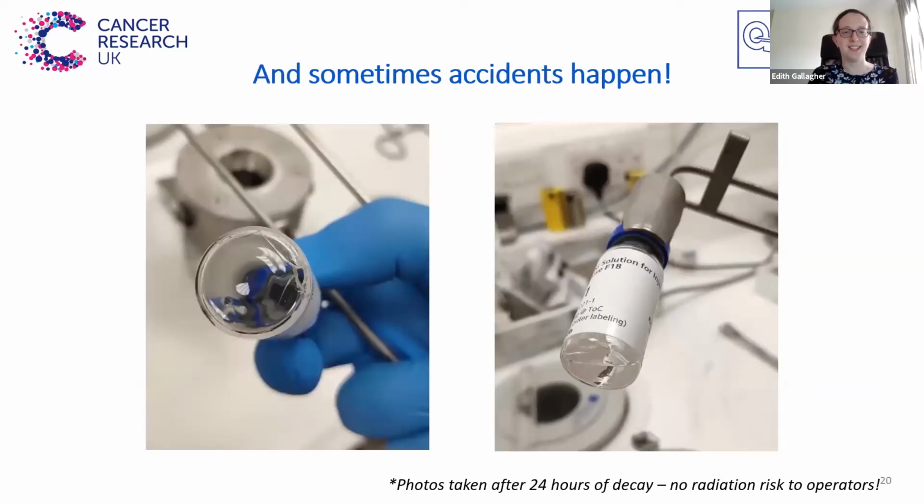And sometimes accidents happen. This is a vial that was recently delivered to a department which was discovered to have cracked in transit. It meant that a number of patients had to be rescheduled for another day, which was unfortunate as the patients had to fast for a minimum of 4 hours prior to arriving, and some had travelled quite a distance.